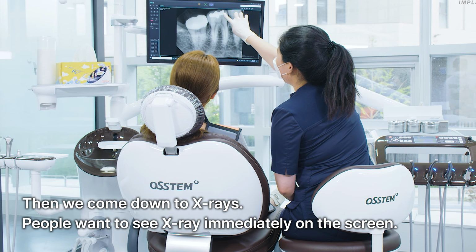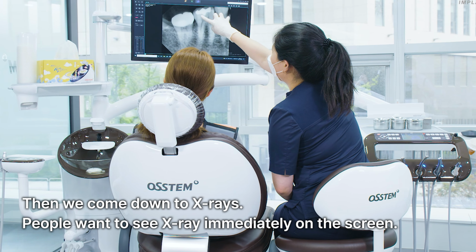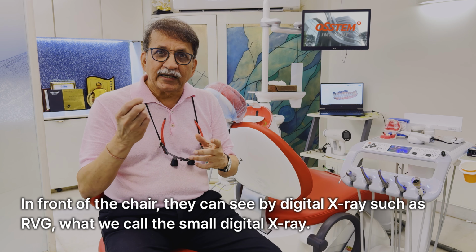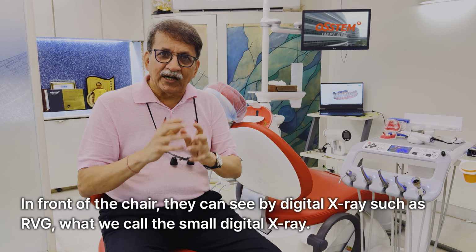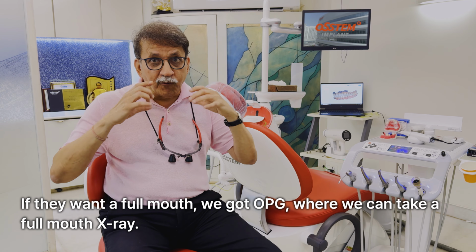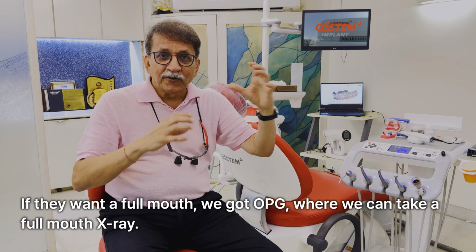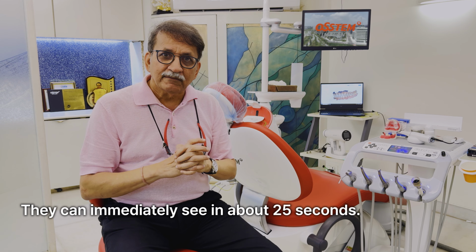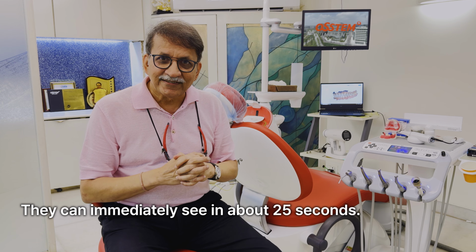Then we come down to X-rays. People want to see the X-ray immediately on the screen in front of the chair. They can see it by digital X-ray. We say RVG, what we call a small digital X-ray. If they want a full mouth, we have OPG, where we can take a full mouth X-ray. They can immediately see it in about 25 seconds.